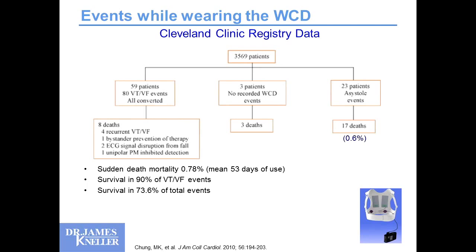In one of those, the bystander pressed the button to abort the therapy, and the patient needed the therapy, so that's unfortunate. Instruct those around you not to interfere. And sometimes when you fall with syncope, the contact electrodes that sense the arrhythmias can be disrupted, and now the LifeVest isn't sensing you appropriately, and that was a reason to succumb. So the contact and the redundancy of the electrodes has improved in response to these things, and we expect all of that to be better.